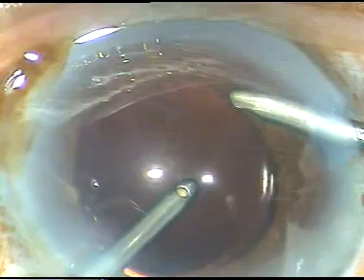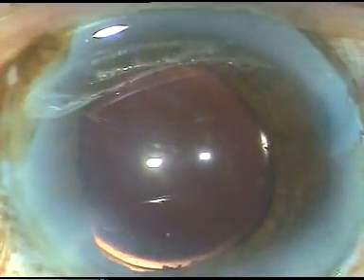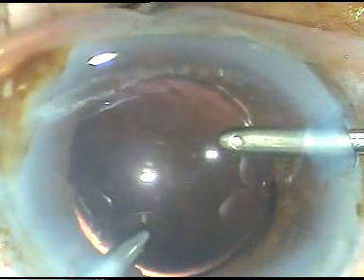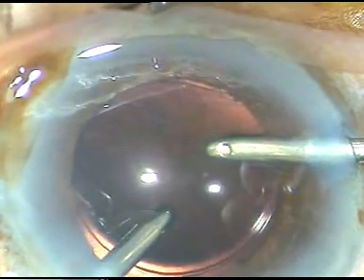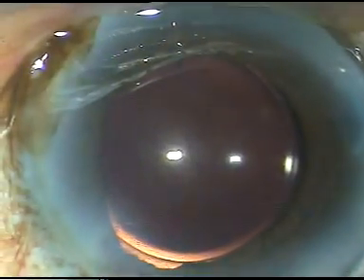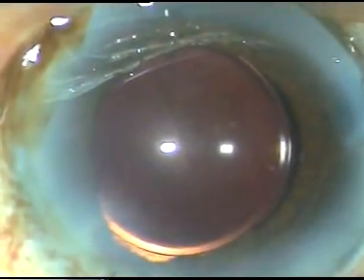Colleagues, we must have courage in our hearts to do such cataracts. Even with a very high-end machine, we have to be very cautious with these cataracts. Thank you very much for your attention — I hope this video will help you in developing your surgical skills.